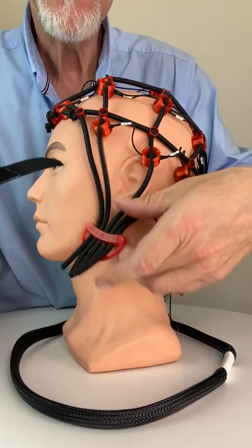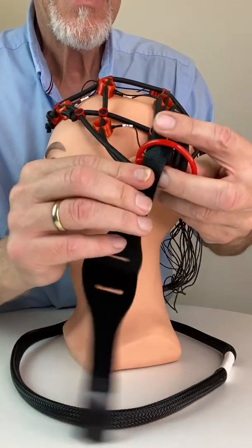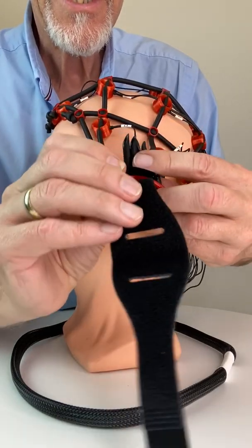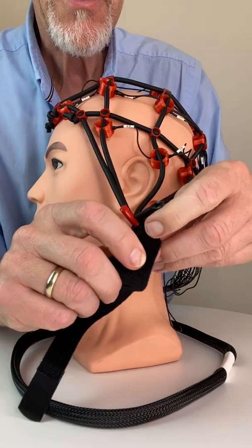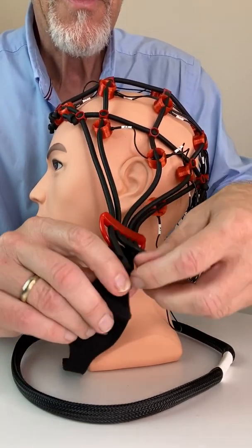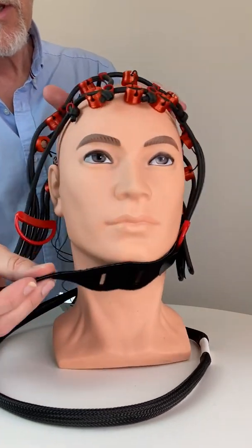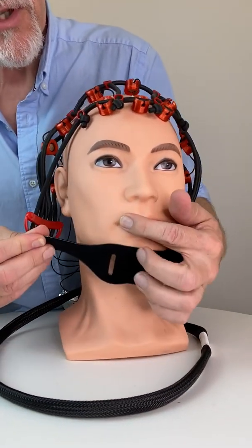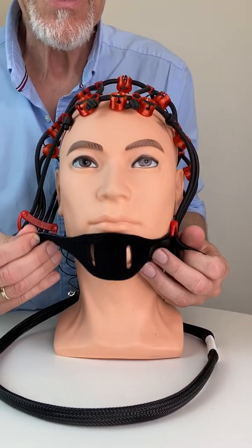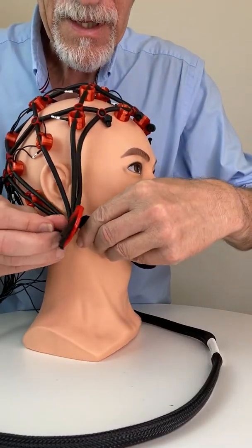This side is the outside and you connect it here so you can easily remove it later if you want to change the cap or take the cap off. We put the chin strap to the other side. You can put the chin strap below the chin or you can also do it differently — up to you. We do it like this now.